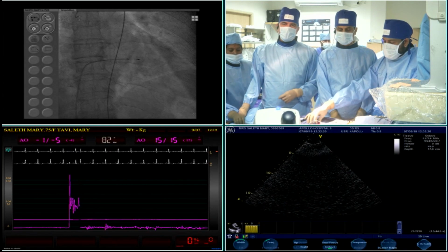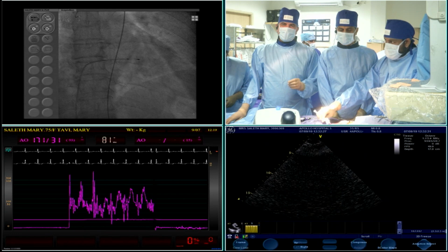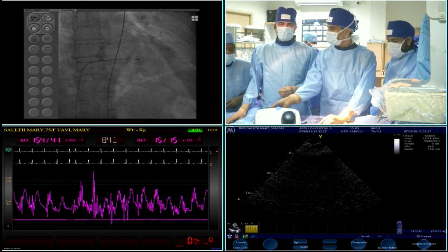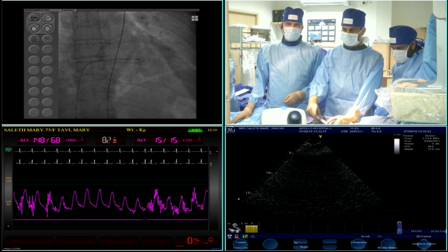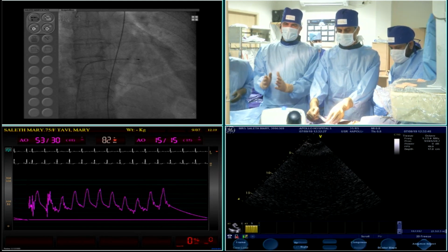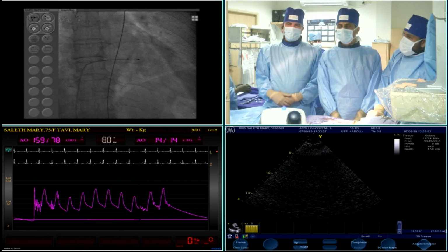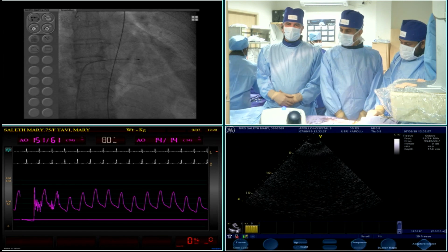We've also noted in the UK that there is a generational divide. As Thierry was saying, those of us who are very experienced with femoral access for PCI procedures are far more comfortable with fluoroscopic approaches than our younger colleagues who are now very ultrasound based. And as we move forward through the generations and TAVI becomes in the hands of the current younger generation, I'm sure we'll see that ultrasound access is very much the 100% preferred technique of choice.